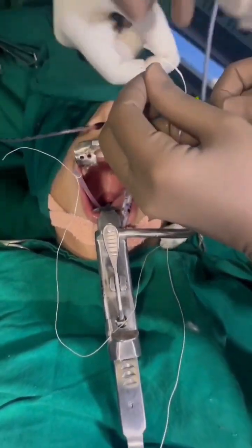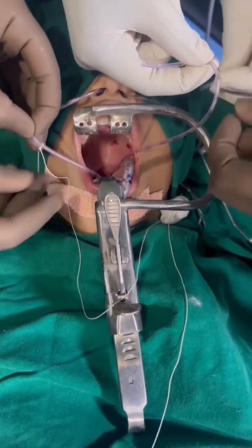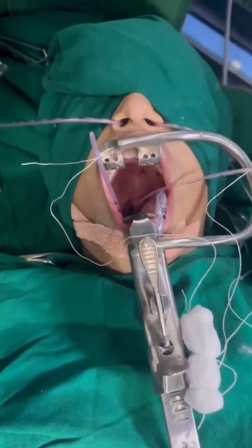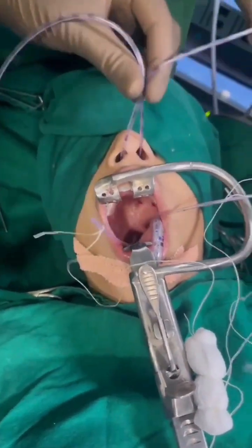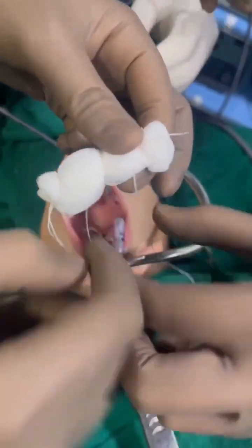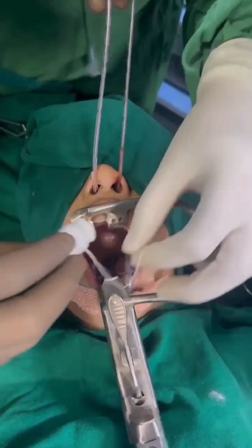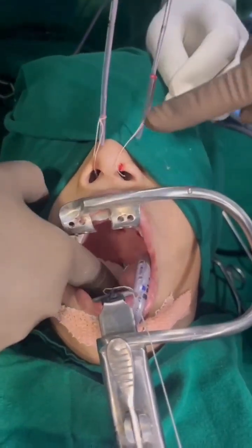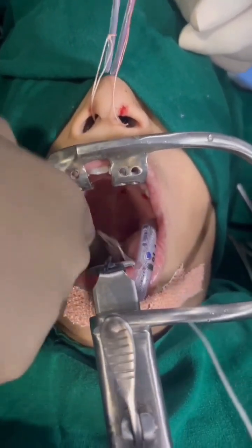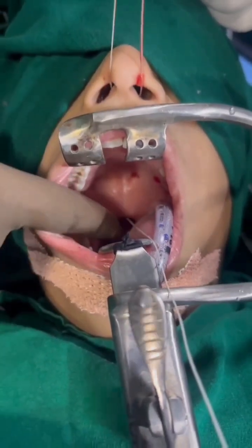Now there are two infant feeding tubes from the nose with the side threads of the bolster dressing tied on the ends. We pull both infant feeding tubes from the nose and gradually guide this bolster into the oropharynx, keeping the single thread outside. We keep pulling the infant feeding tube until we get the thread out, and with a finger we push the bolster through the oropharynx past the uvula down into the nasopharynx tightly.